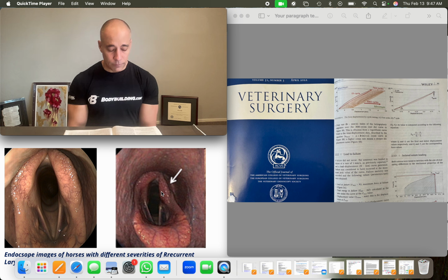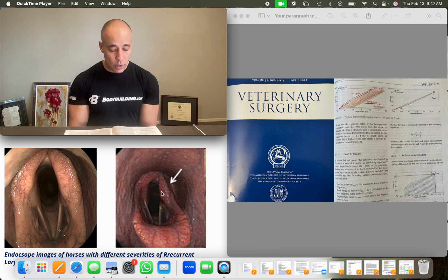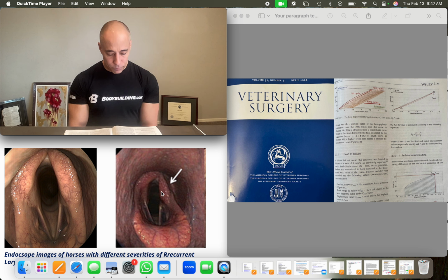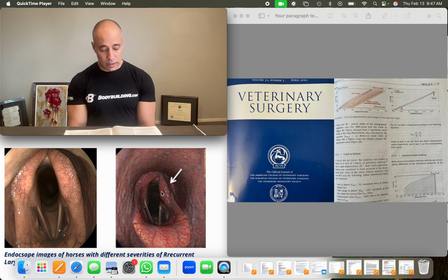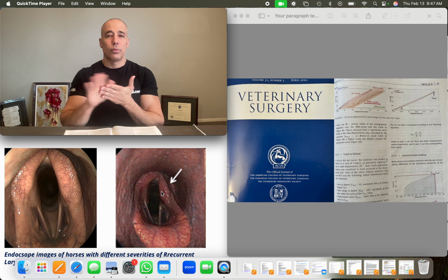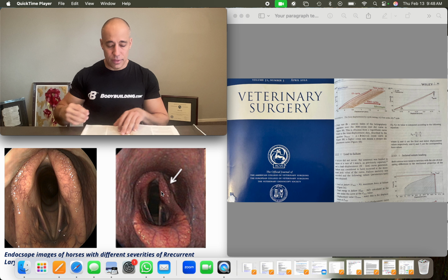The approximately circular cross-sectional area of the ethibond decreases when subject to a tensile force due to the positive value of the Poisson ratio, Poisson being P-O-I-S-S-O-N, it's about 0.3, resulting in a low tensile stiffness, whereas Tiger tape cross-sectional area was less affected by this phenomenon due to its tape nature. Indeed, the Tiger tape contact area seems to distribute the pressure more evenly, especially in cases where pull-through is a concern. So we're seeing that the flatness of the Tiger tape helps with the distribution of pressure when it's being stressed versus the circular cross-sectional area of the ethibond.